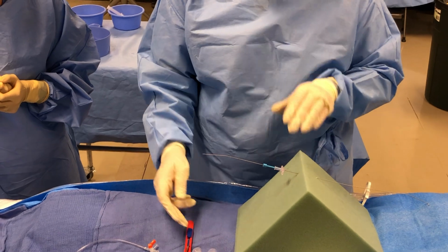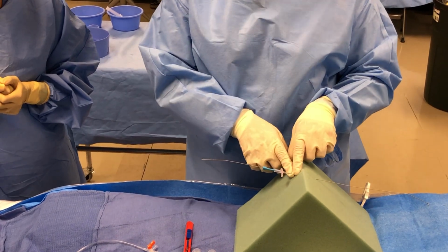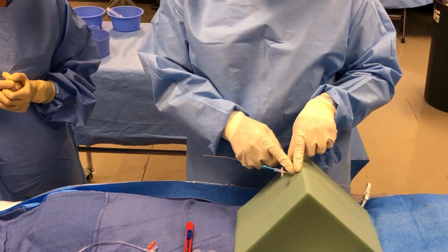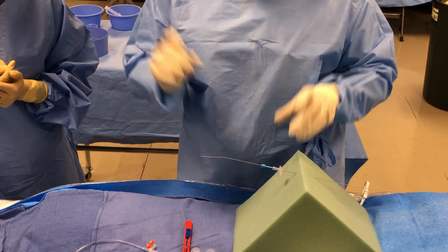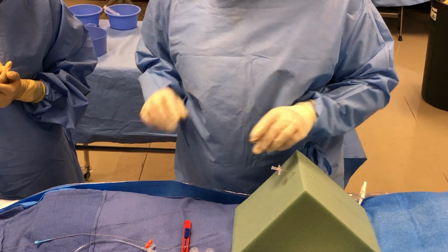Now, there is another point. They could wait until they have the needle out and just have the wire in to make the nick. You might see some do that. This is when you don't stop and do the nick in the skin though.